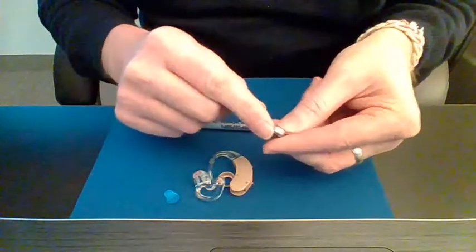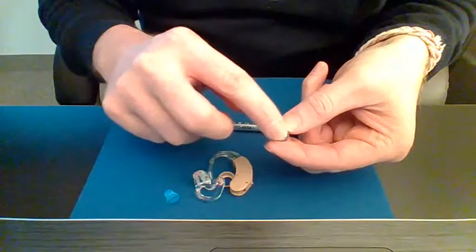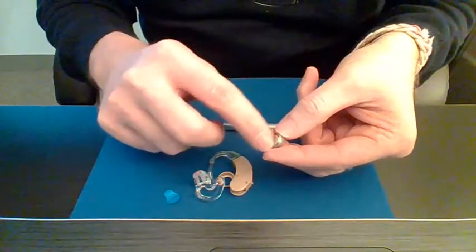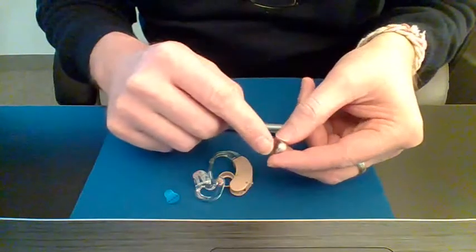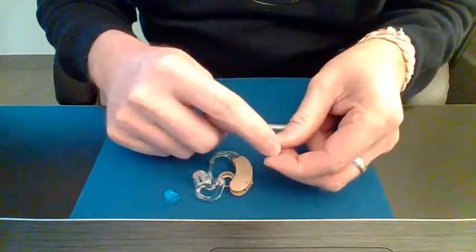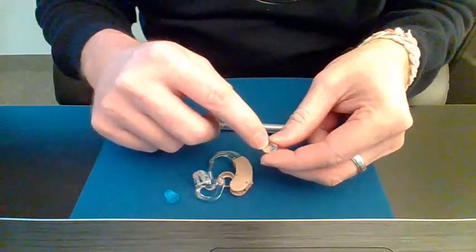And then you've got a beveled edge. The beveled edge is the bottom of the hearing battery. So the flat part, that's the top.